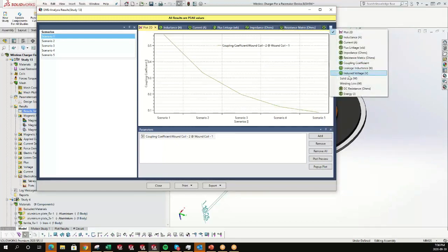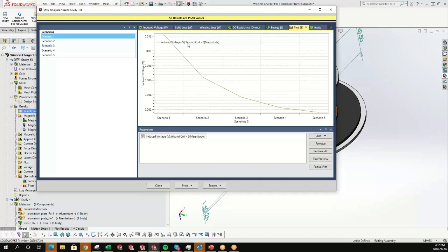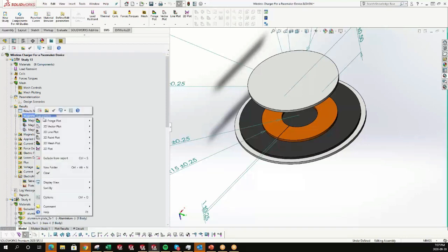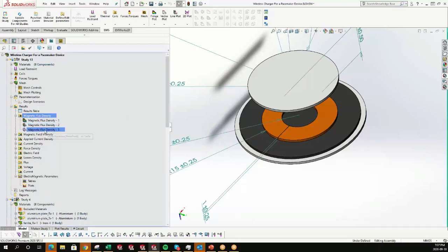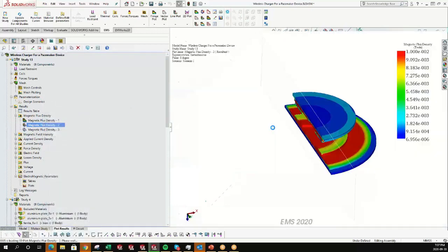Let's have a look at the induced voltage. We can plot real, imaginary, or the magnitude, and here is the induced voltage. Different 3D results are allowed by EMS, so we can see different plotting options: section and iso plots, vectors, fringe plots, lines, streamlines, points, and so on. Let's open this and show it.